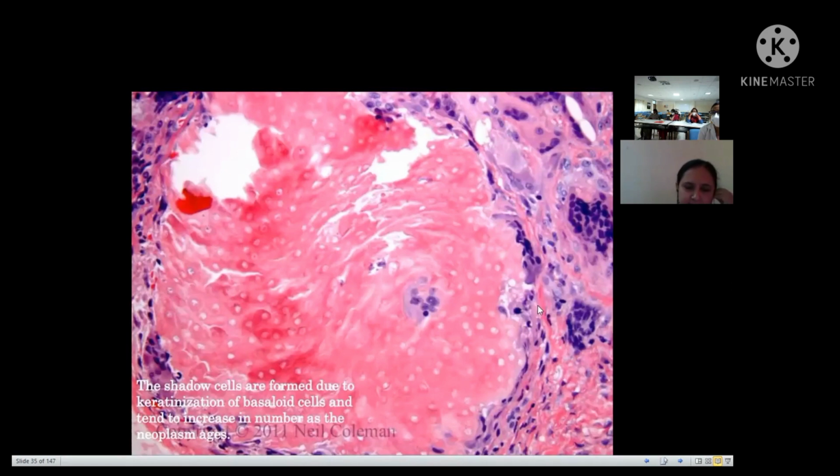In the hair follicle there are so many varieties of keratinization, and this I believe is the seventh type. The cortex and medulla show some keratin and form a hard keratin. The internal root sheath keratinizes by forming trichohyalin granules. The outer root sheath shows tricholemmal keratinization, the infundibulum shows epidermal keratinization, and the germ cells also form some horn cysts.